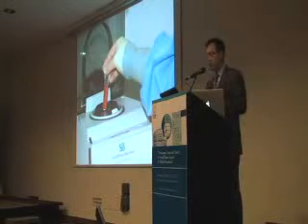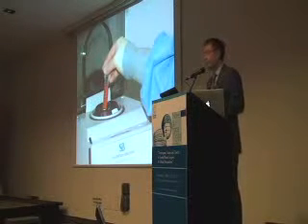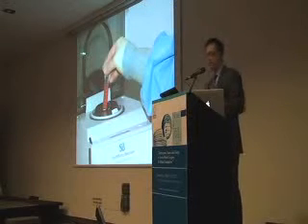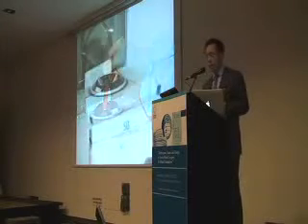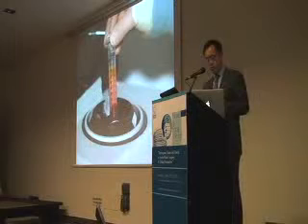I've learned from my mentor, Mark Glassgold, about this, and he taught me how to just centrifuge it. I don't even know if he centrifuges anymore. I don't think it really matters. Just find someone that's done it for years, has shown longevity, and then copy that technique, because there are many ways to skin a cat, and this is just one of them. After you centrifuge, 3,000 RPM for 3 minutes is what I do, you get the supernatant and infranatant.